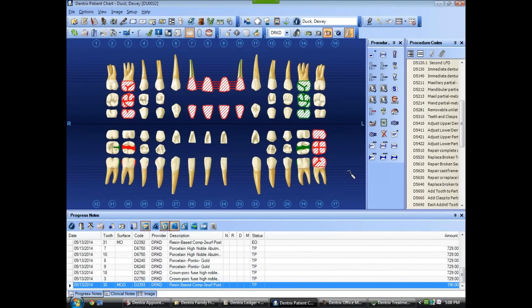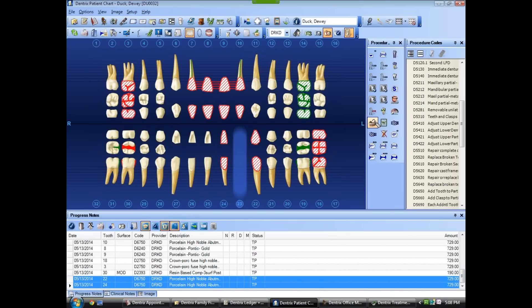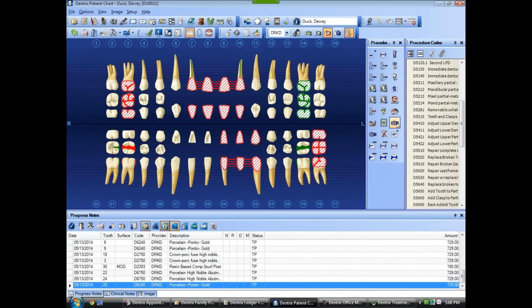Because we have a missing tooth number 23, we better do a bridge down there too — a bridge from 24 to 22. It looks like all our existing restorations are in there, the missing teeth are in there, and our treatment plan is in there. We can see the treatment plan down below and we're ready to go to the treatment plan.